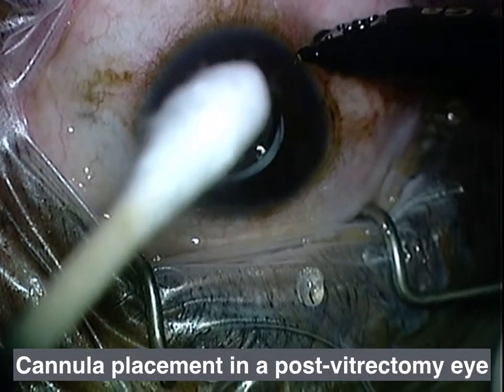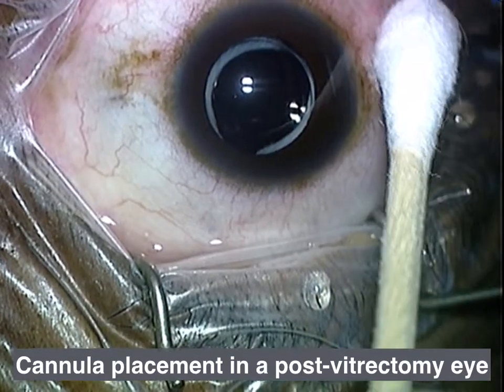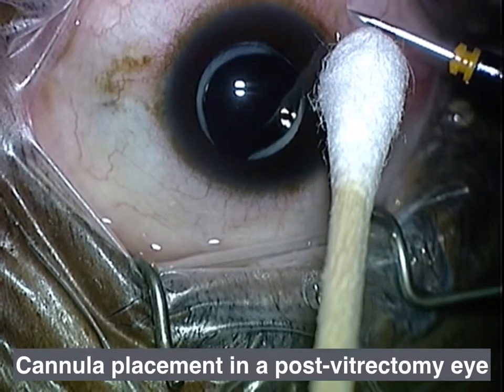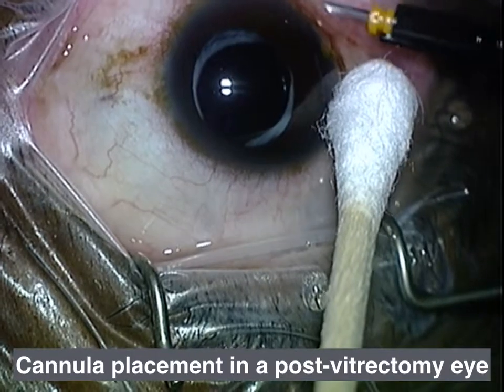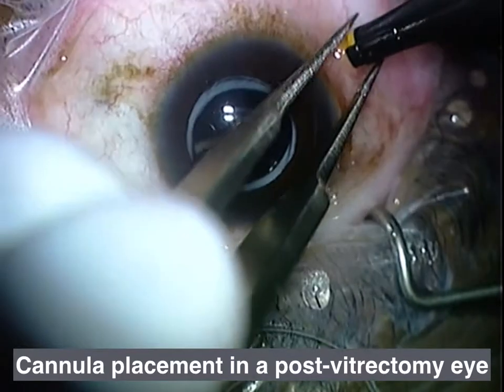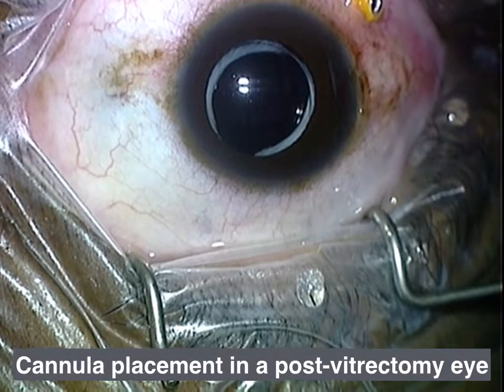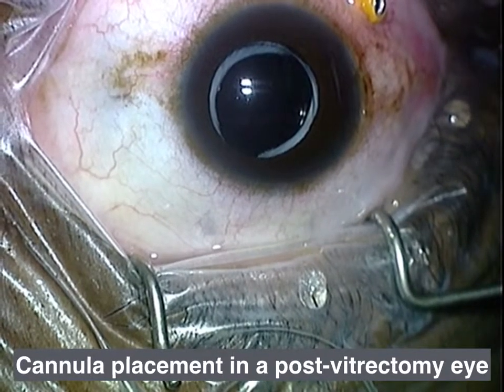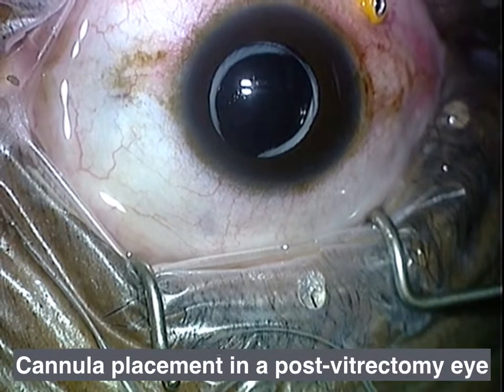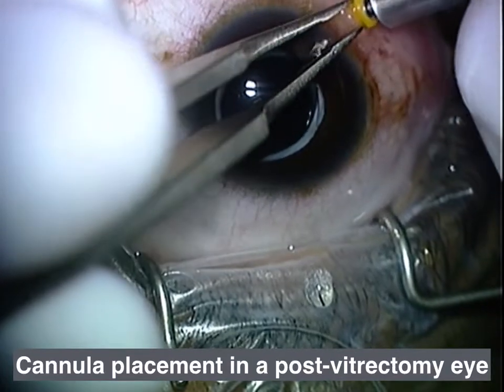You can see here I'm marking the eye. This is a 23-gauge vitrectomy before the era of valved cannulas, about five years ago. I'm coming in at about a 30-degree angle, maybe 10 to 20, and then I slowly slope up to close to 90 on that one. That one was not a problem because the eye was still filled with fluid. Notice all that fluid that just escaped from the eye.